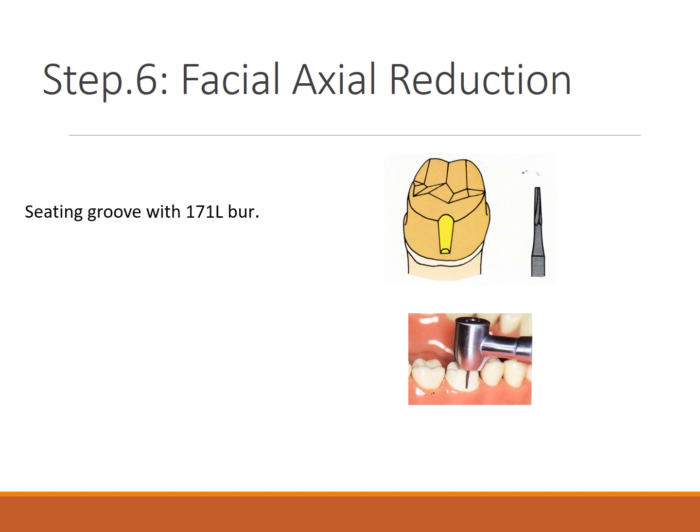I always tell the people who are doing preparation that tooth preparation is exactly the same form of the big teeth. Basically it's a miniature version of the actual teeth, with the same cusp grooves, line angles, point angles, everything the same. So we cannot change the morphology, guys.